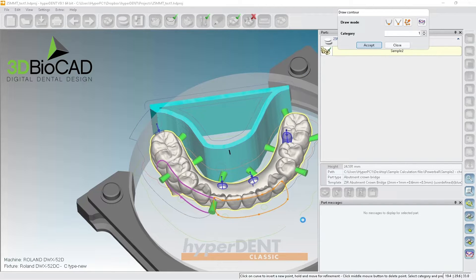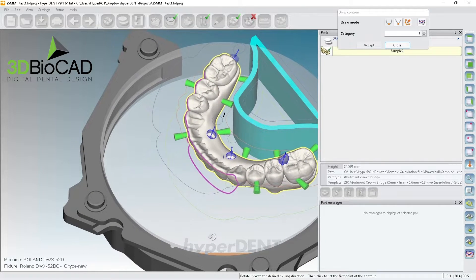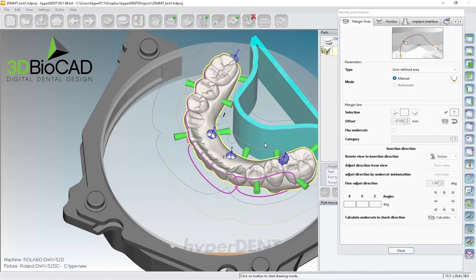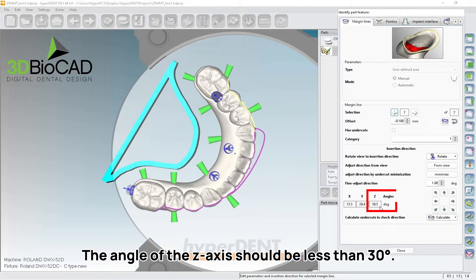I'll click probably right here, and then right here, and then I probably need to do here as well. Now the boundary has gotten a lot bigger. Let's check the angulation — this one is at 30.5, so I need to make it within 30 degrees.